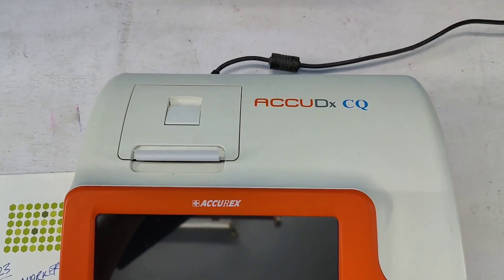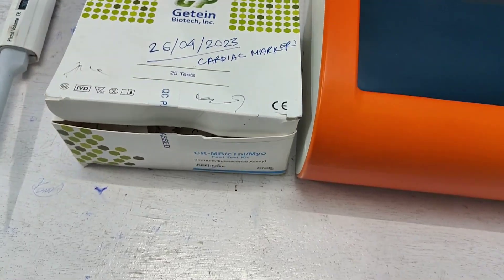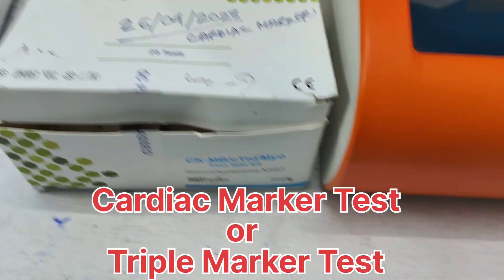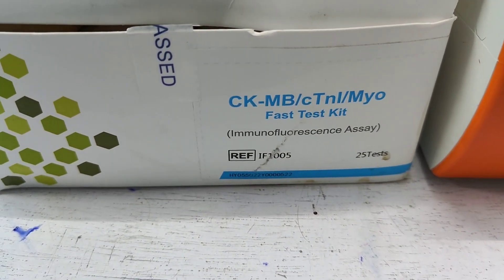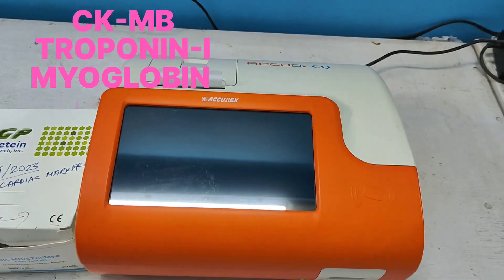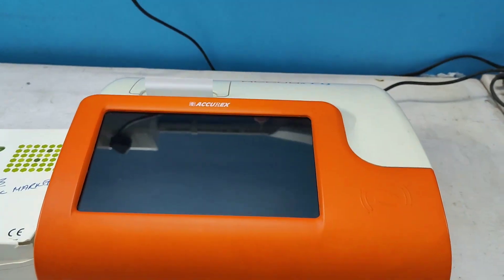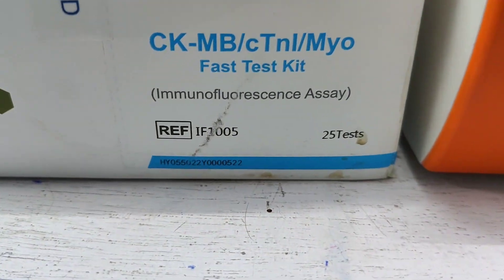Hello friends. By using this machine I am going to show you a cardiac marker test, also called triple marker. With this kit you can see CKMB, cardiac troponin I, and myoglobin — it is also called triple marker. By using this machine we can process this test, and the method followed is immunofluorescence.